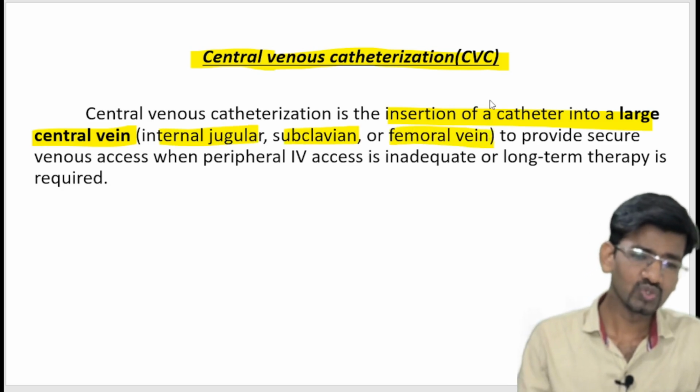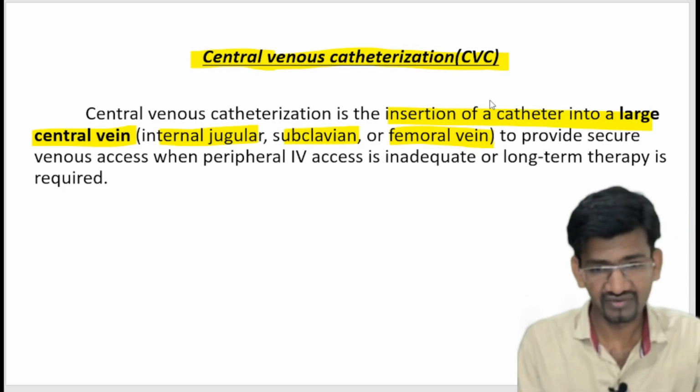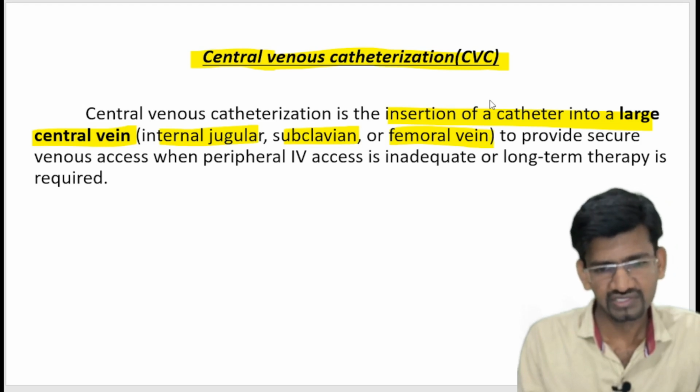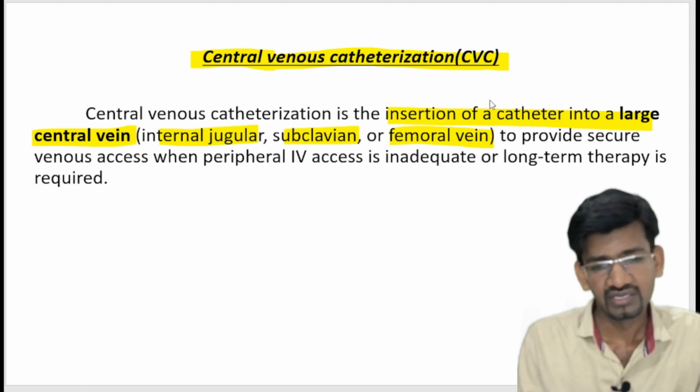Why do we need central venous catheterization when we have peripheral venous catheterization? In some patients peripheral IV access is not possible, or it is very difficult to get.